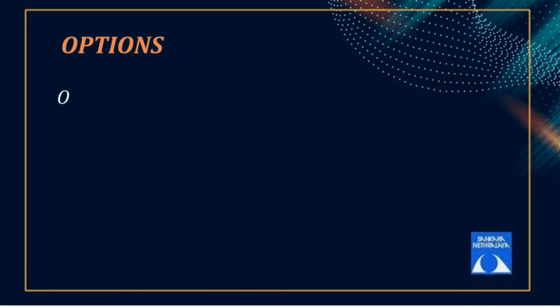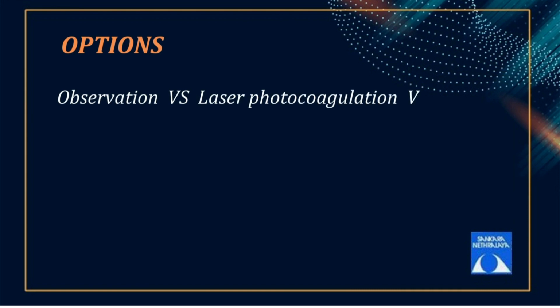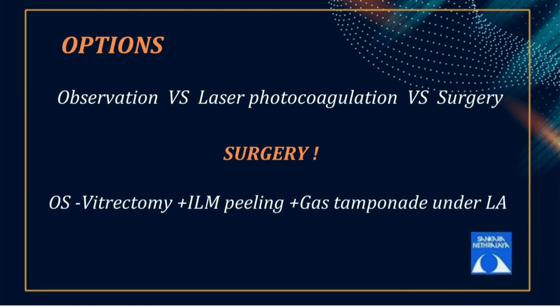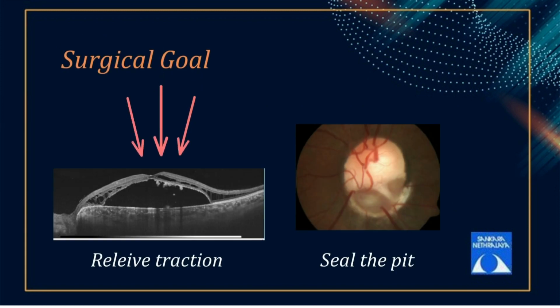The option of observation versus laser versus surgery was explained to the patient. Patient decided to go ahead with surgical management. Hence, left eye vitrectomy with ILM peeling with a gas tamponade under local anesthesia was planned. Our surgical goal was to relieve the traction over the macula and seal the pit.